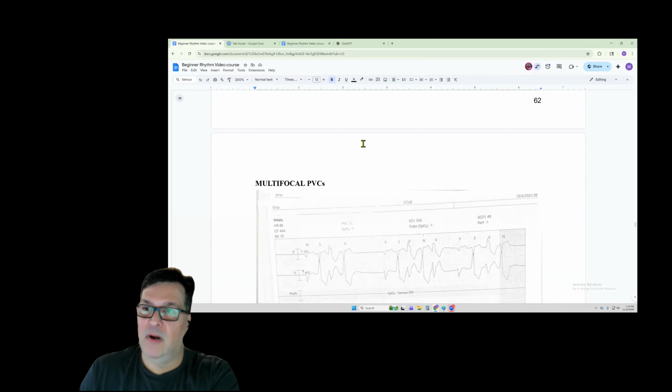MAT is just way over 100. Oh, all SVT would be over 100 though.